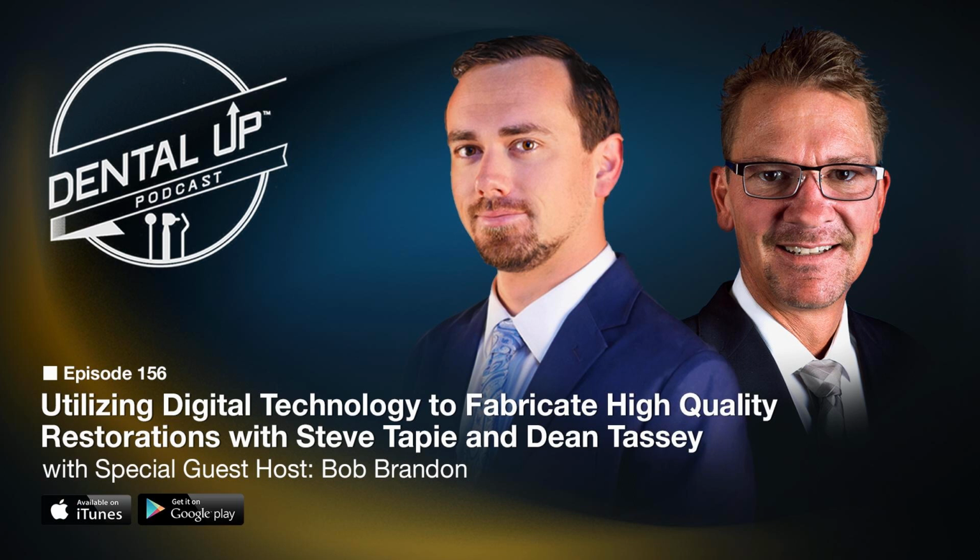Like Dean was saying, as long as we get a clean scan, not a lot of scatter, a clean scan of the scan body, it comes out really nice. And of course, we'll contact you if we don't have enough information, whether sometimes we have some tissue issues or the scan bodies. I've talked to a couple of our customers whose scan bodies were too tall and they weren't able to scan the full scan body, so we said, well, we need to get a shorter one. So it's a lot of communication.